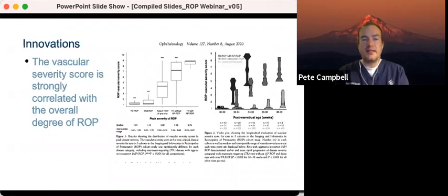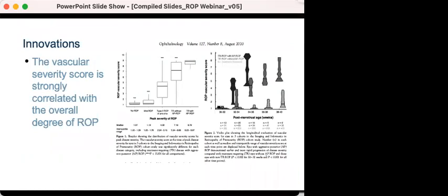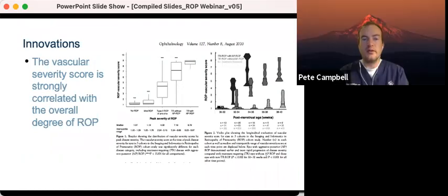We've then validated that several different ways, comparing the vascular severity score that you get from a single posterior pole photograph, and shown that it correlates with zone, stage, plus, and extent of stage 3. That is, a single photograph corresponds to the whole overall severity in that eye. The second is that it can be used to monitor disease progression over time, identifying those babies progressing towards treatment-requiring ROP. You'll notice this is a US population, so the post-menstrual age may be different in different parts of the world, but you notice that the curves start to separate up to a month or so before babies end up getting treated. And we have new results we can talk about in how this might play into risk modeling.